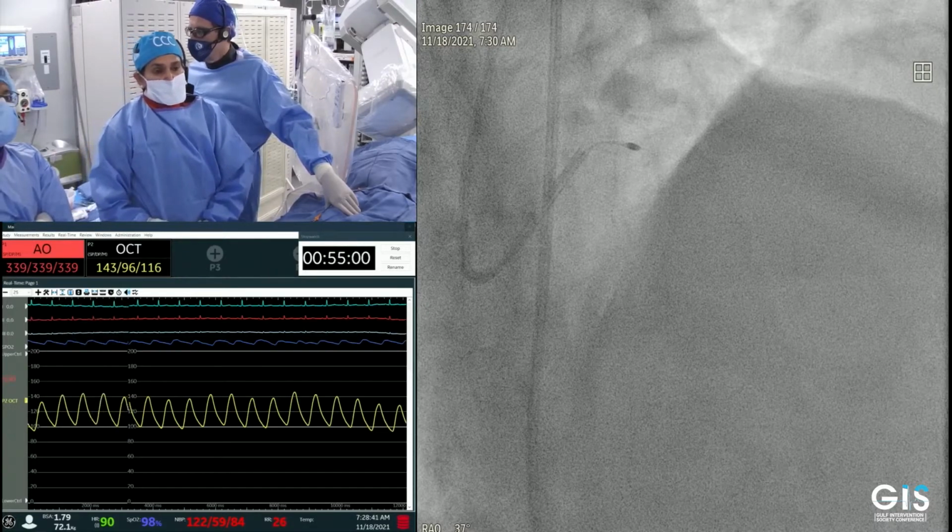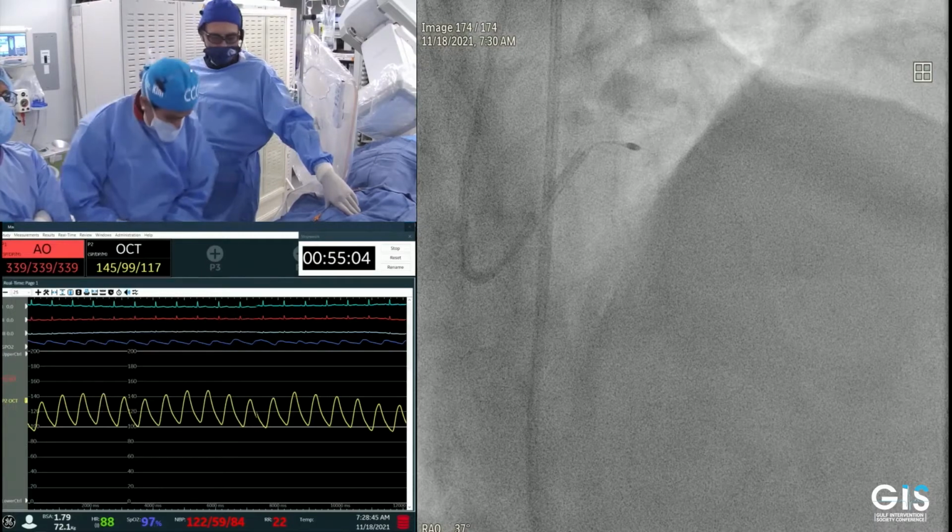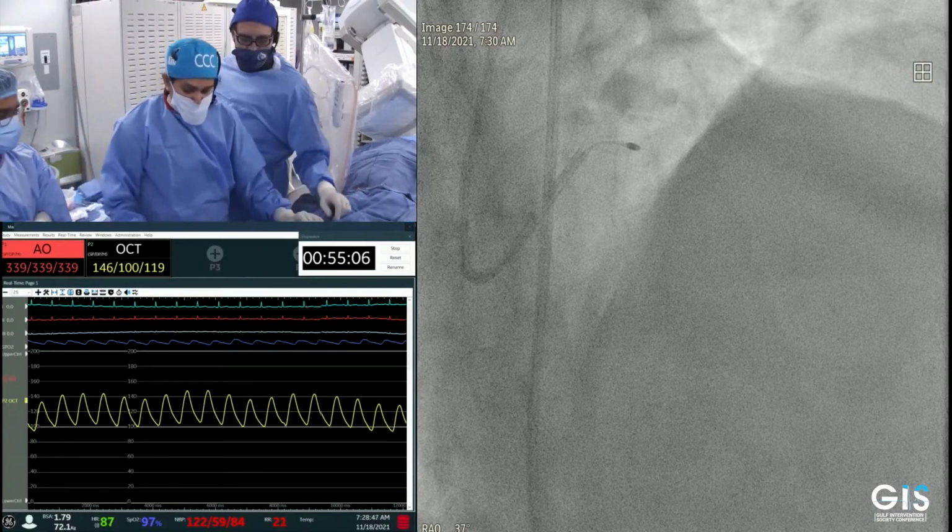I don't know whether it's registered in the United States or not, but here in Europe and in our region, I think shockwave, this is an ideal case for this.